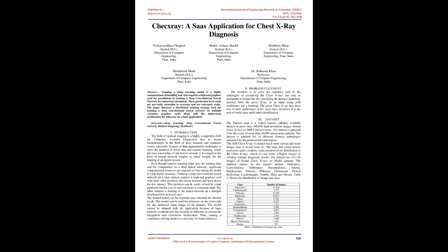The paper discusses a distributed training strategy used for training a deep convolutional neural network on multiple consumer graphics cards, along with the deployment architecture for inference on a SaaS application. Keywords: deep learning, deep convolutional neural network, medical imaging, healthcare.